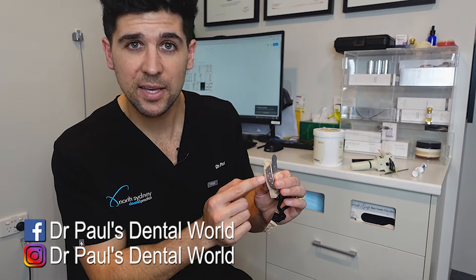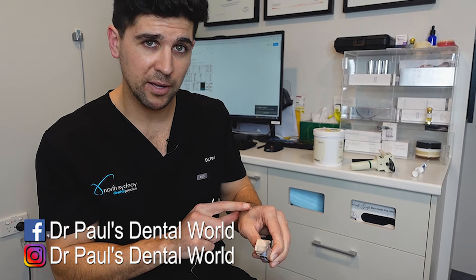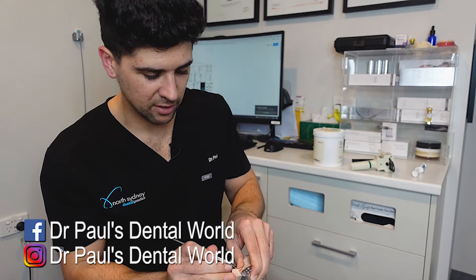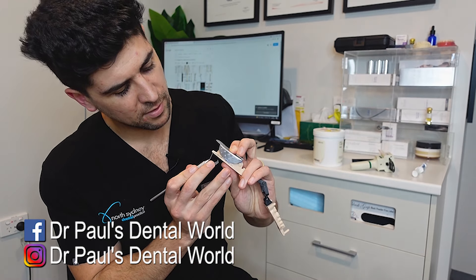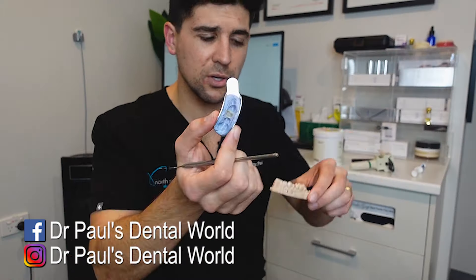Because I've got some excess here, I can actually test to see when that's ready. So I've got my probe here. I can feel on the back of my glove — has it set yet? I can feel that it's getting close. And I can see that it's almost set as well. Alright, so this is how it looks.